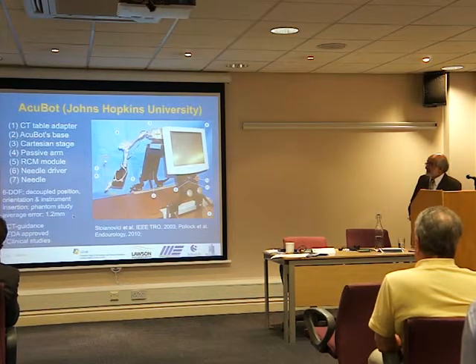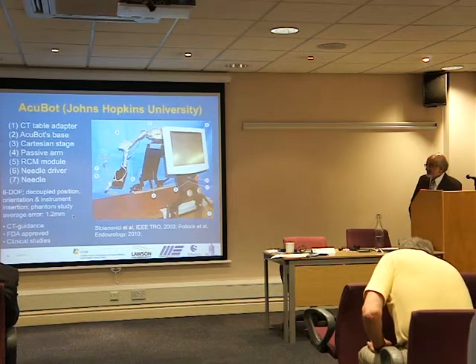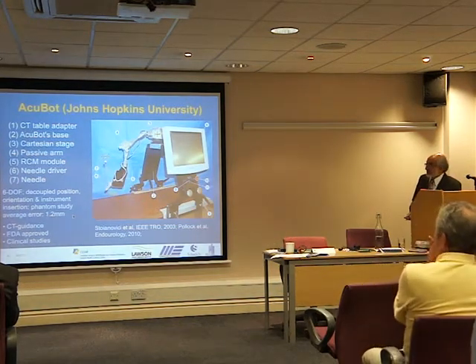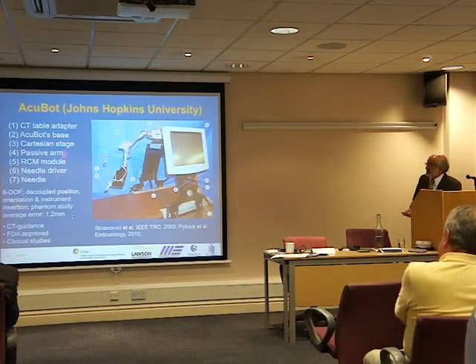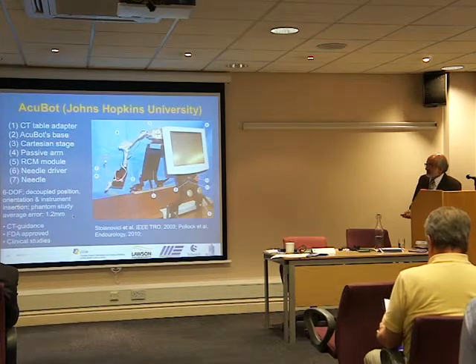This is one of the first systems that was developed at Johns Hopkins. There is a company that was marketing this. I'm not sure if the company is still in business because there's a lot of competition since then. This system is fully automated. The needle driver actually inserts the needle.